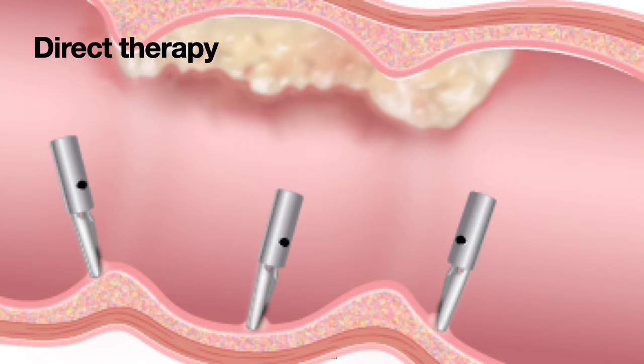I also use clips after finding a cancer, if the patient is going for surgery, to place a couple of clips near the cancer site in the colon and take an X-ray, so that if the patient goes for laparoscopic surgery, the clip might help the surgeon place their ports.